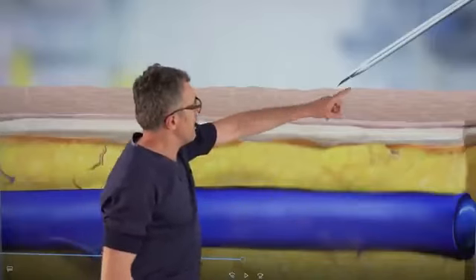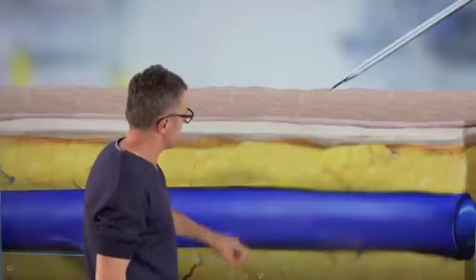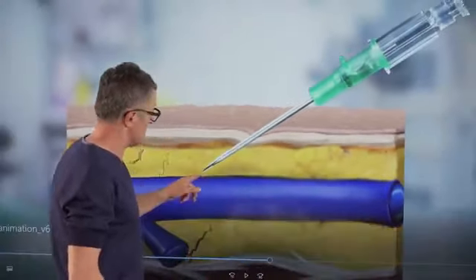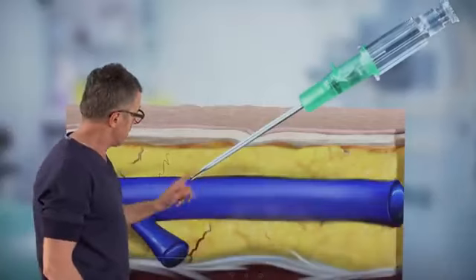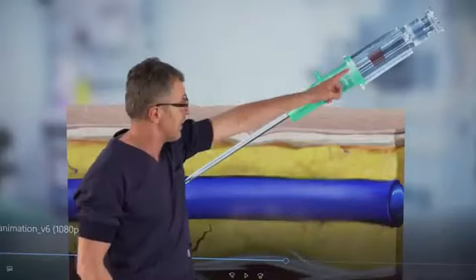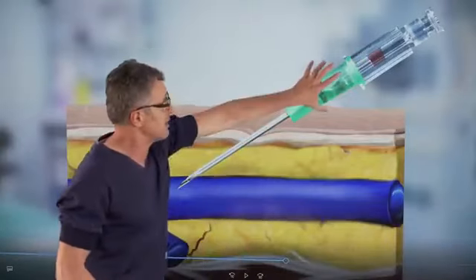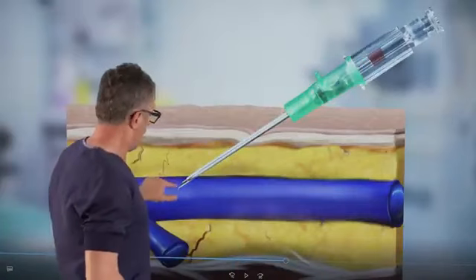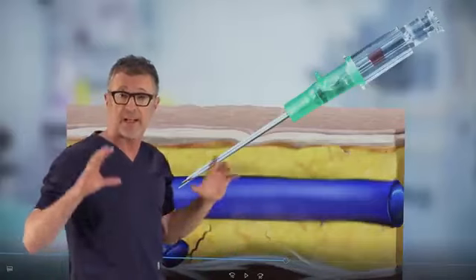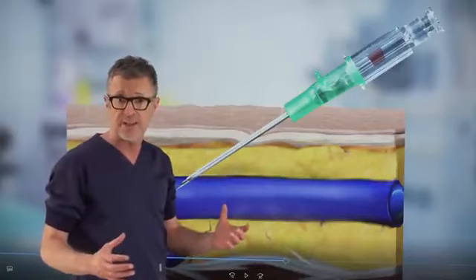Mistake number two. In this case, we have a catheter needle system that is just about to pierce the skin. Let's watch this. As the catheter needle system goes through the skin and the dermis and approaches the vein, you can see the needle opening is now inside the vein, and we immediately see the flashback in the monitoring chamber. This really means that the opening of the needle is now intravascular, inside the vein, but it does not necessarily mean that the catheter is also inside the vein.